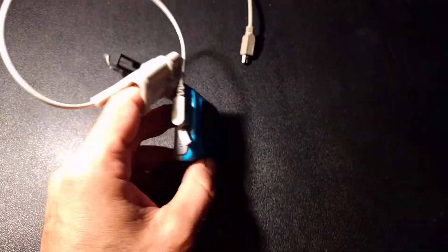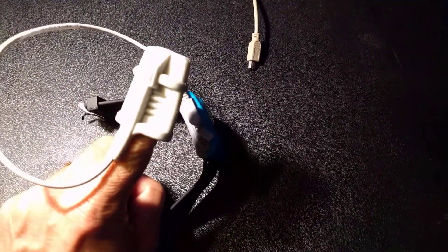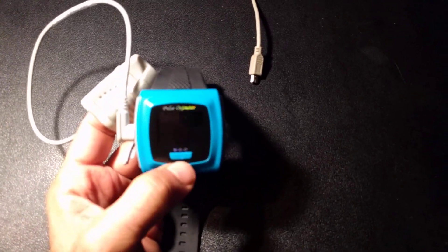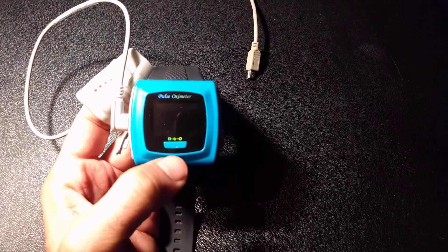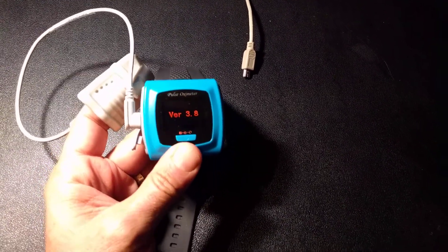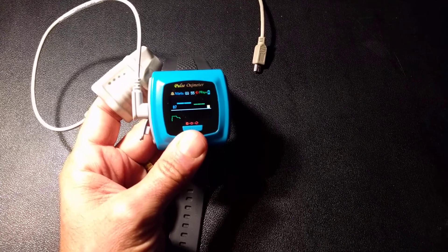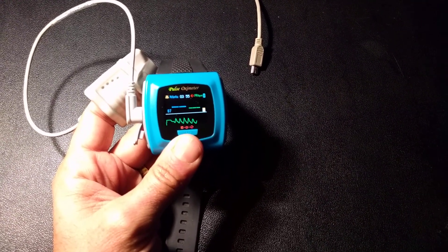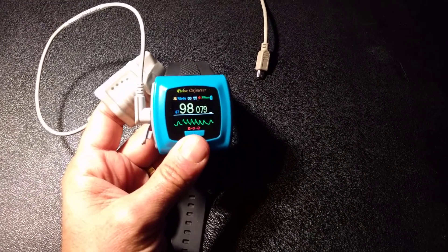There's short press and long press. When you put on the probe, make sure you remove any fingernail polish or anything, and you're going to get a good reading. Turn it on with a long press — that's holding the button down. Long press goes on. I'm getting a reading.